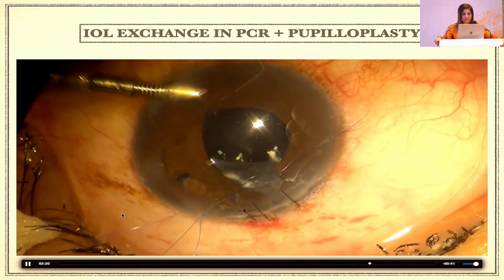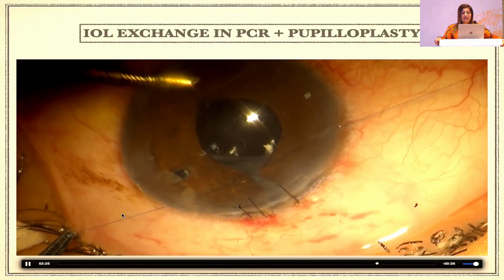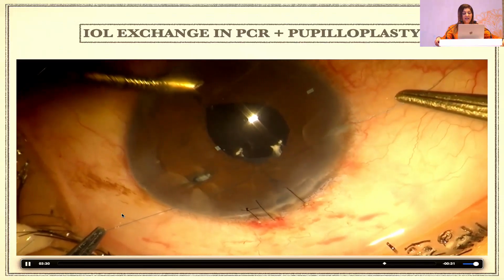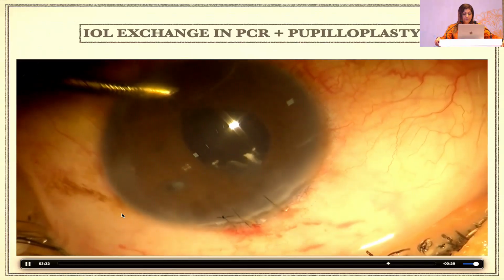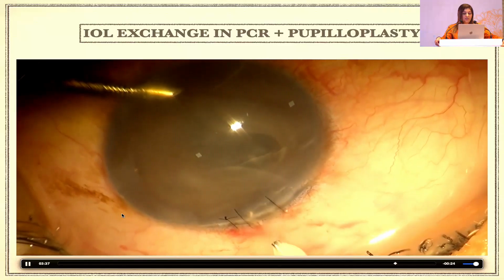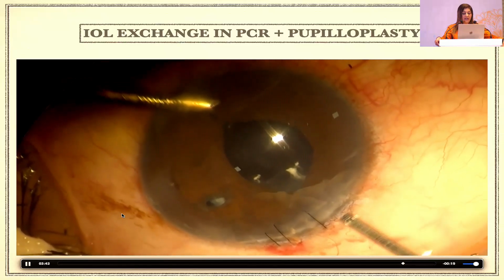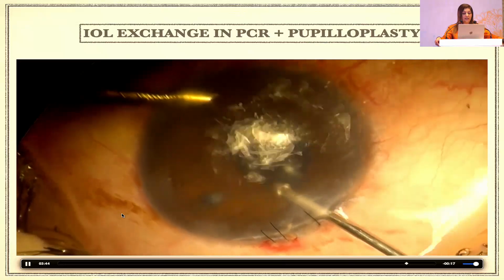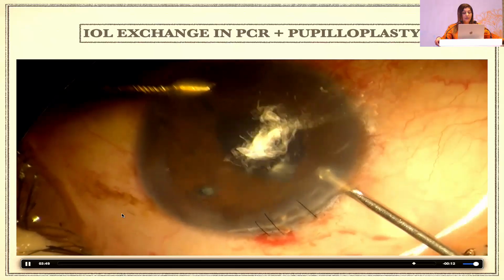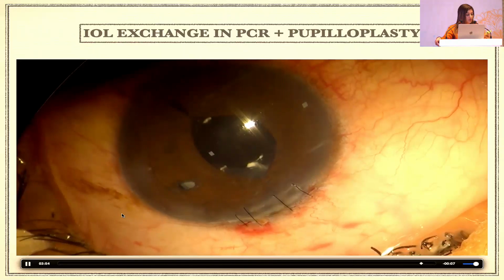So this is the single pass 4 throws, always taken in the same direction, and then you just pull both the suture ends, and it beautifully slips inside, and then you can just cut them off. So you take up an end-opening scissors or a long arm scissors, whatever you have in your system, and you can cut that suture. Always stain. I have a habit: I always use triamcinolone at the end, to make sure that everything is going okay inside the anterior chamber. So these are some of the things that I would like to share.